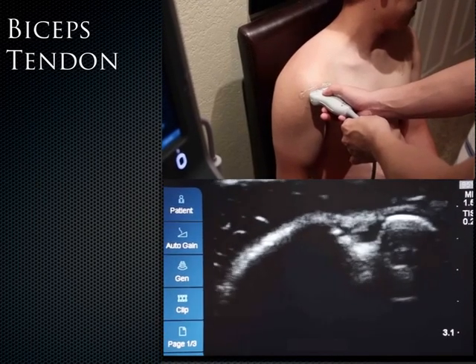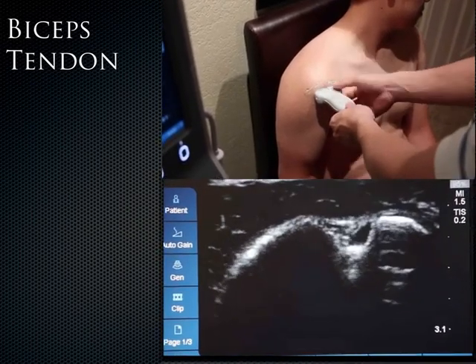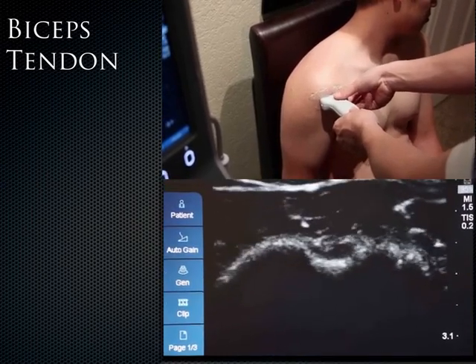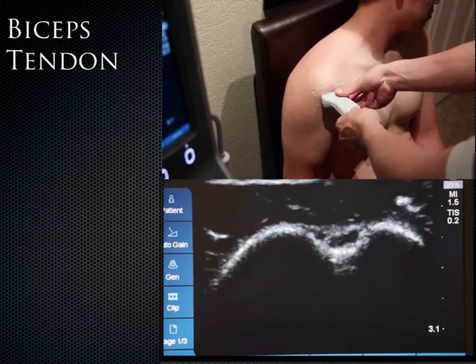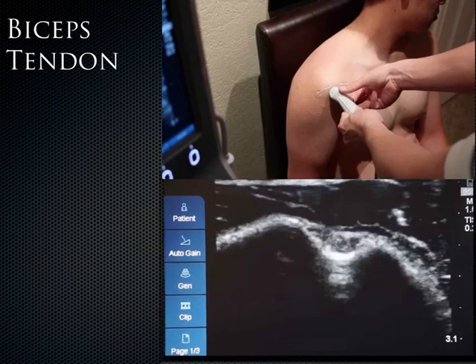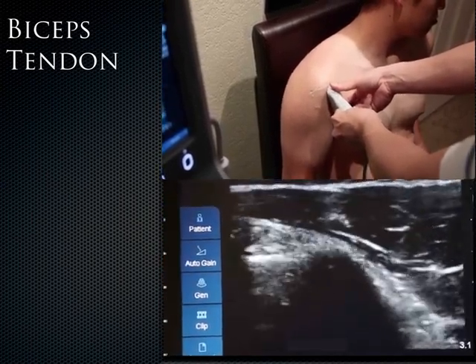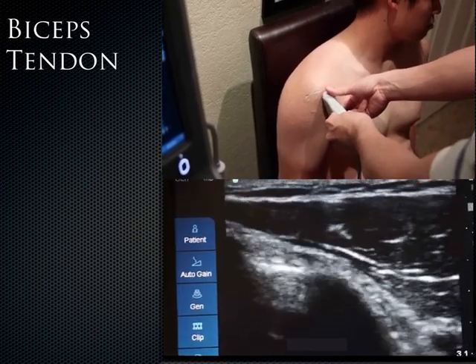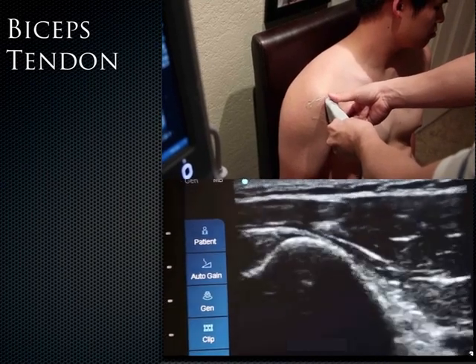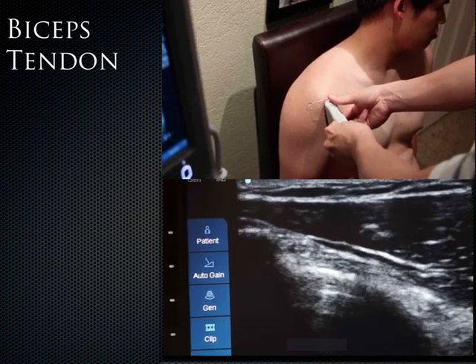For a long axis view of the biceps tendon, I'm going to start from the short axis and hold the probe, putting a finger on the patient's skin so that I know the probe isn't going to move anywhere. I'm going to rotate 90 degrees with the indicator pointing towards the patient's head. This gives me a view of the biceps tendon in the long axis. I'm trying to get it right here. Here we are. Now I'm just going to follow it down.